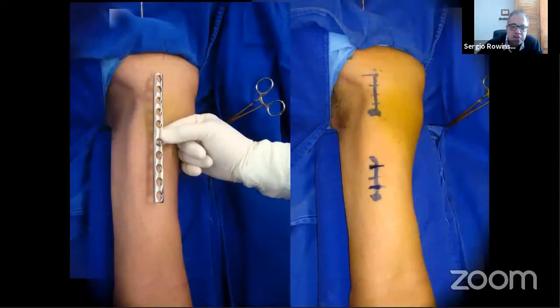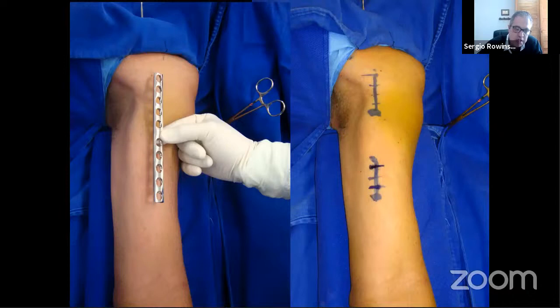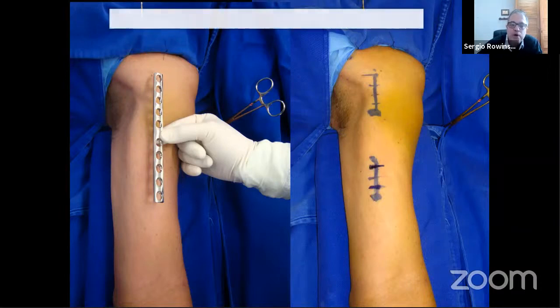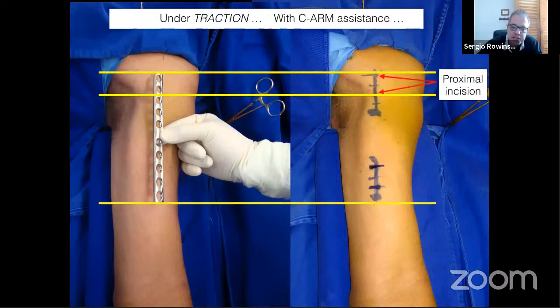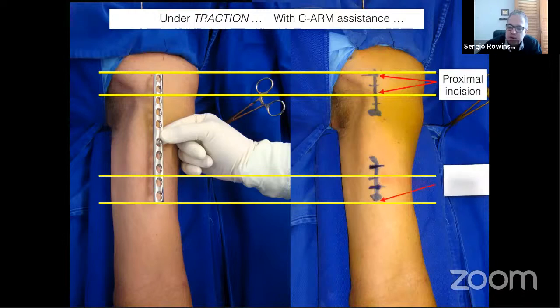So this is what I do under traction: reduced fracture, delicate, constant traction, and a little flexion of the elbow, always under traction and C-arm guidance. This is going to be the 2 last screws, as we are seeing here with the arrows, my proximal incision, and the same idea. This is going to be here, my distal incision.